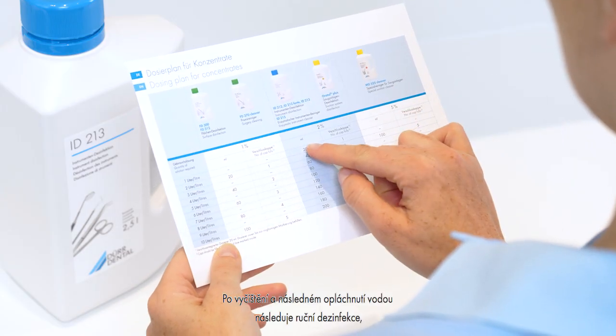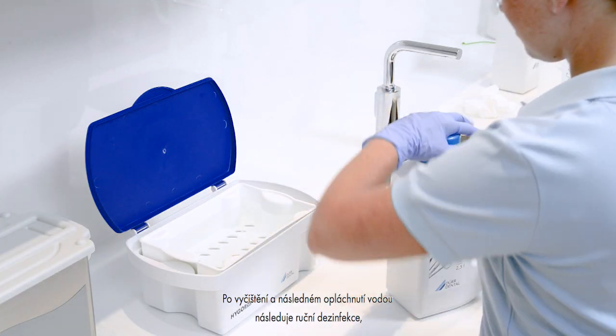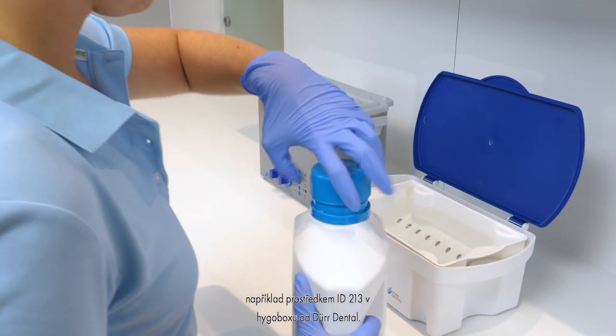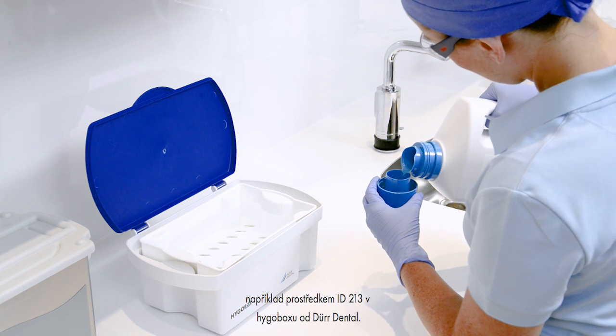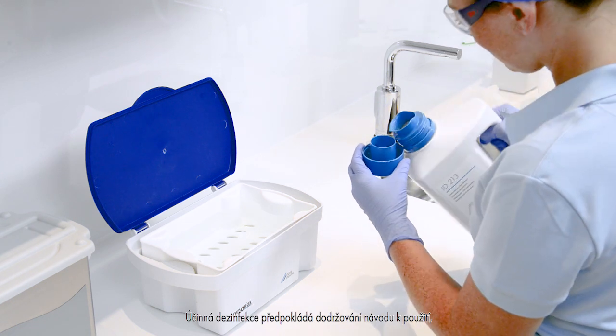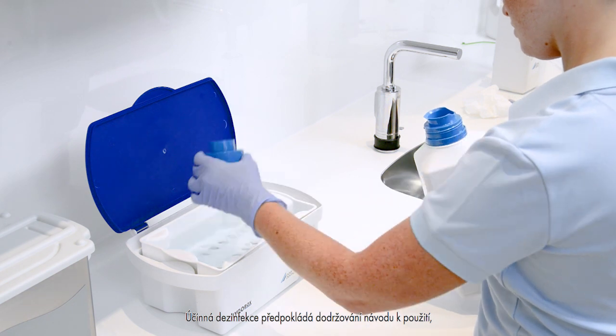Manual disinfection. The cleaning and subsequent intermediate rinsing with water is followed by manual disinfection, e.g. with ID213 in the Hygo box from Der Dental. Following the operating instructions, especially the concentration and exposure times, is the prerequisite for effective disinfection.